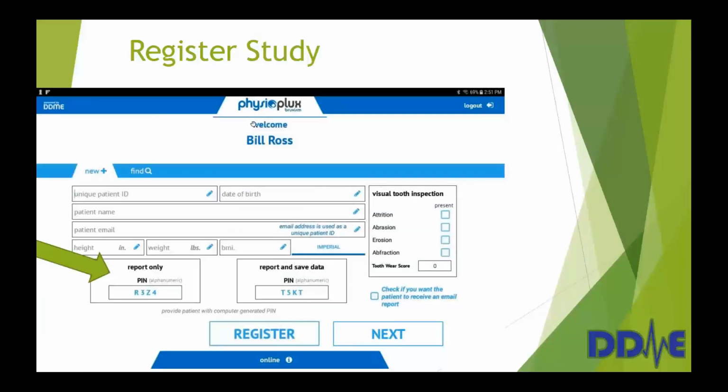Next, a really important topic, report-only PIN. Okay, the tablet generates this number. And for the purpose of our initial training for the PhysioPlux for Bruxism app, the report-only PIN is what we recommend. And it will always start with an R for report only. And then there'll be, in this case, R3Z4.